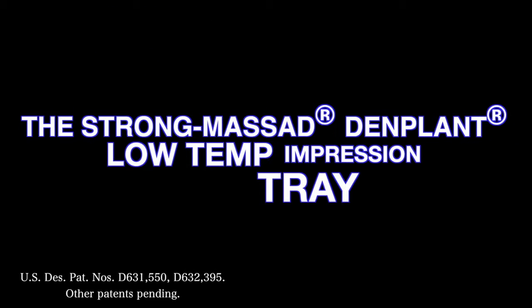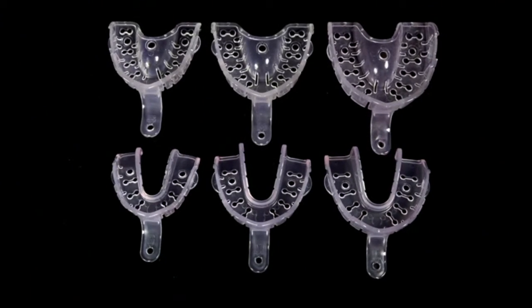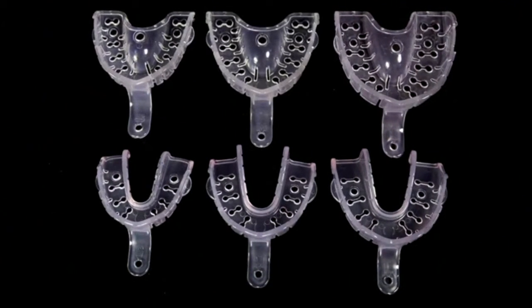The Strong Mossad Denplant LT Low Temperature Impression Tray is the first step in achieving custom tray quality impressions in various dental situations.